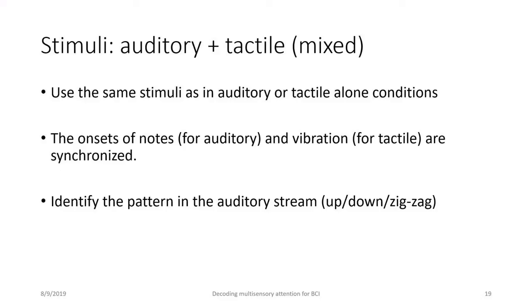And we can combine the two together, playing the audio and the vibration together, and synchronize the onset of those notes and the vibration pulses. The subject could choose to pay more attention to the sound, or more to the vibration, or to both of them together. The initial idea is that the vibration may help us focus better, because there's a complexity in our neural nerves and also the tactile ones, and they may fuse at some higher level. However, according to our feedback, it's not the case during the experiment, because people may be distracted by the tactile vibration. Unfortunately, it's more like divided attention rather than selective attention.